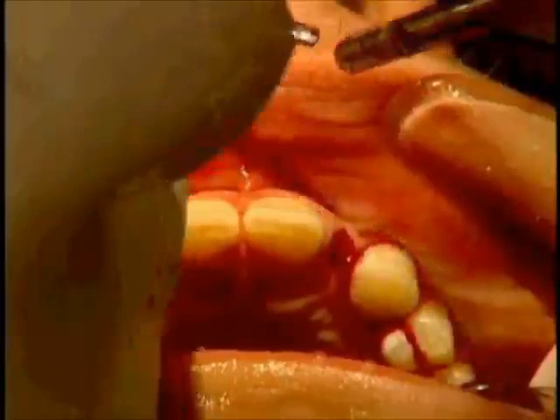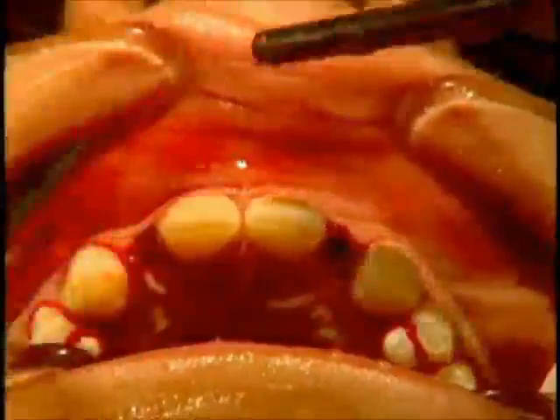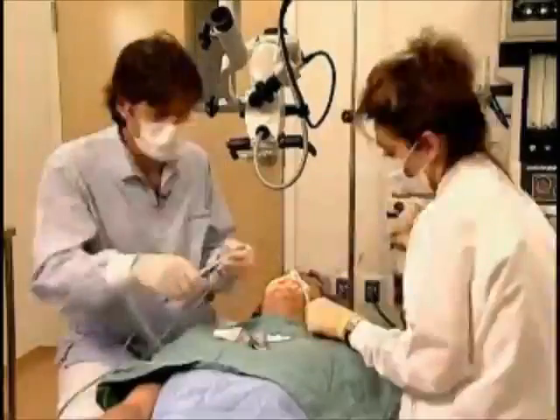This is all the patient's own bone. So we're going to keep it all in one suction. Laurie's not suctioning anything but the bone. Good.